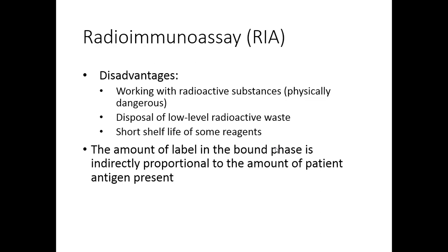This has a relatively short half-life, just under 60 days. I want to say it's 59 and change. So as far as radioactive substances go, it has a relatively short shelf life. Two months for something that you have to order in and bring in, and it's expensive and it's got to be monitored and all sorts of stuff. It's not necessarily something you want to be dealing with a lot. So the short shelf life is somewhat problematic.